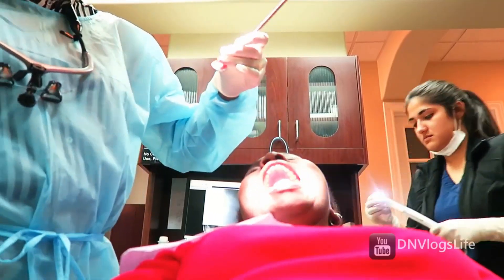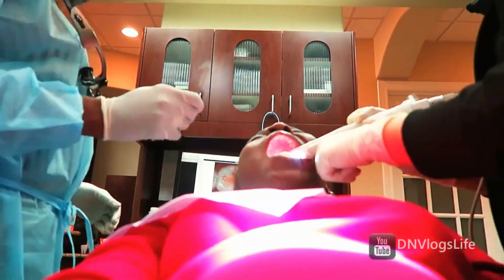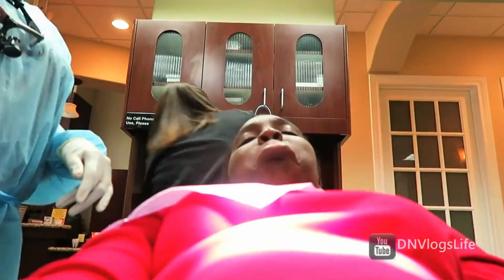So I thought, well, it does get plaque out. But when I went to the dentist the last time, my dentist said I have some tight areas that I need to be flossing. And I said I'm using the water pick. She said the water pick is good, but you still need to use a pick or a flosser.